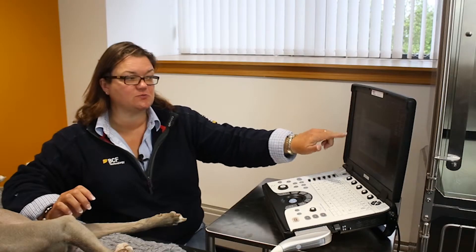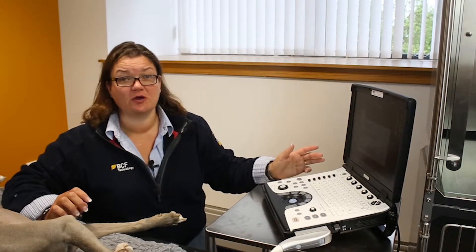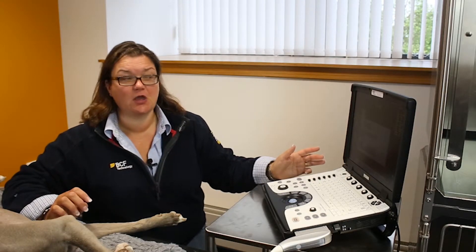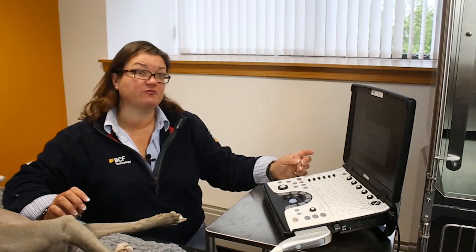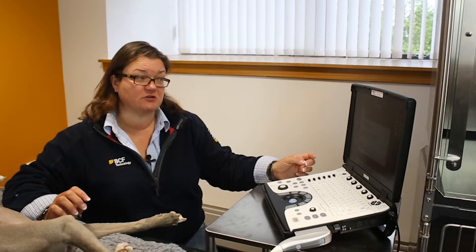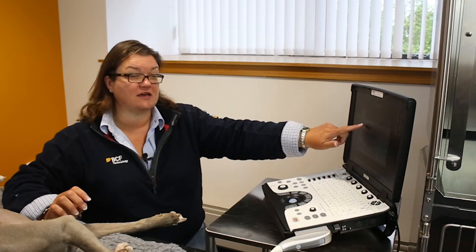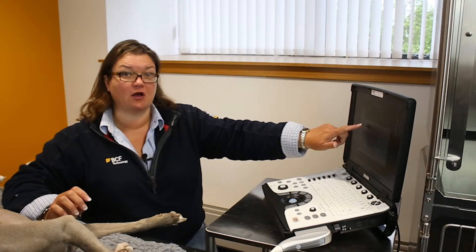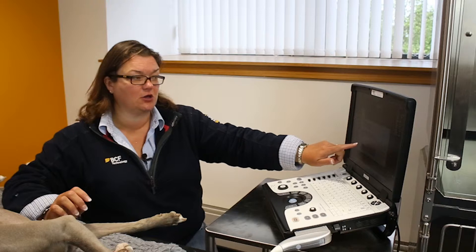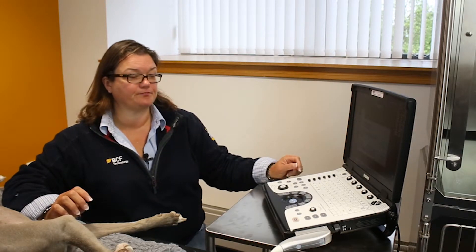These presets will change depending on which probe you have attached. So if you have your phased array probe plugged in, for example, your cardiac application will be highlighted and you'll have cardiac presets along the bottom here.